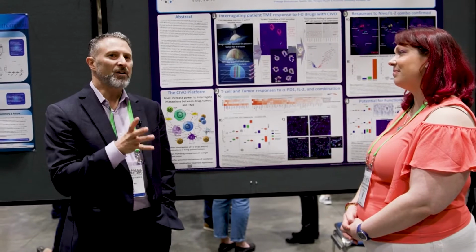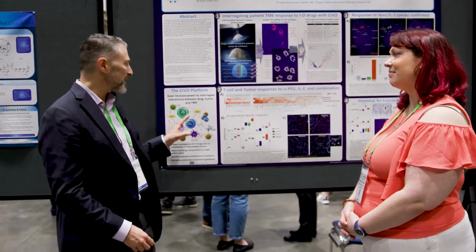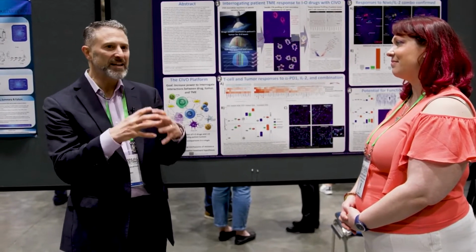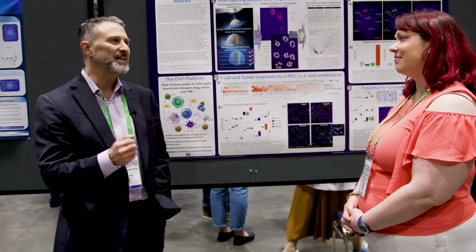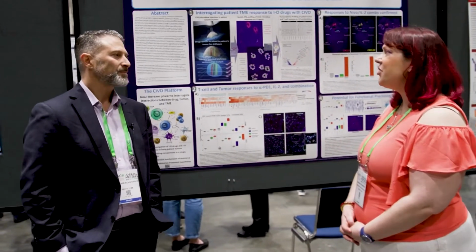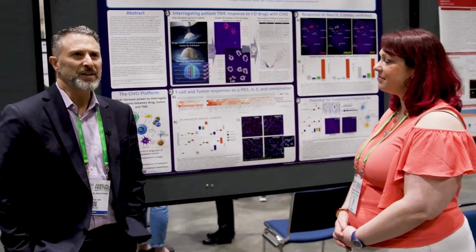Look, I really appreciate all the work that's going on with organoids, but we want to know what happens directly in that tumor in its native state while it's still in the patient, without any further manipulation than a needle stick and a drug microdose. Yeah, no, I definitely see that. But could you see perhaps in a research lab, someone might want to use your device in that manner? Absolutely. So in the research lab setting, you can still generate really important information, particularly using DSP.